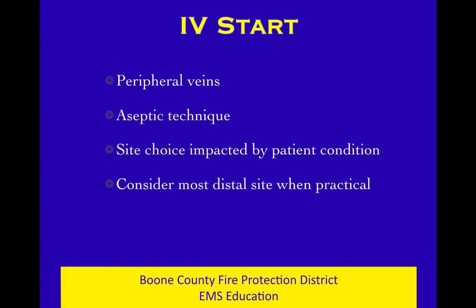In fact, a lot of hospitals consider that we in the field are dirty people and can't start aseptic lines, and they'll change out our IVs just because it was started in the field. So if we've already gone to a proximal site, then anything distal to that is pretty much not available, and we might decide that our patient is not particularly unstable, not horribly sick, and so we might spend a little more time and go a little further distally and then help that patient throughout the course of their hospital stay.